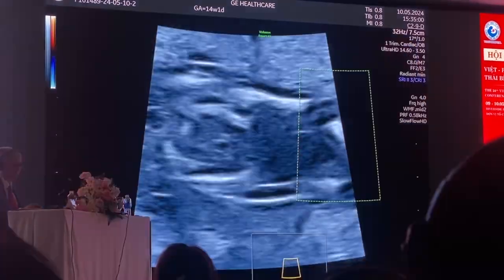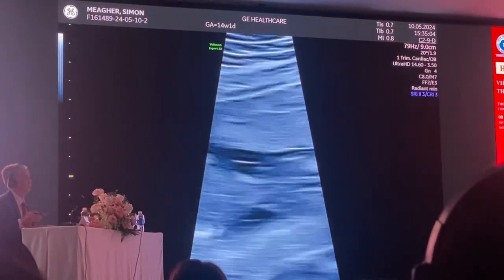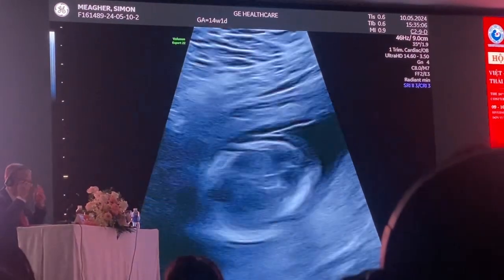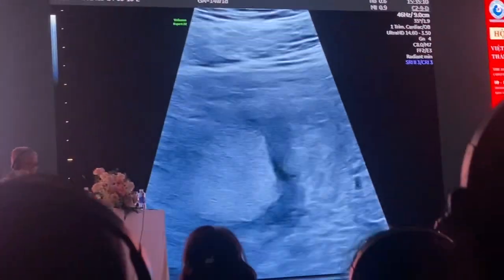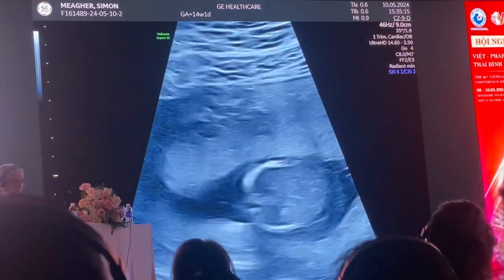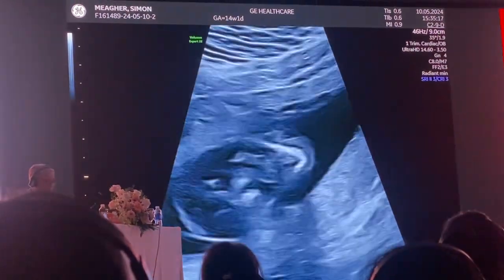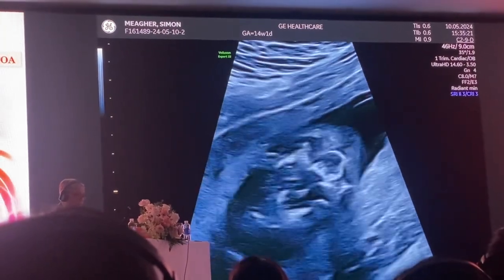So I have not found a cardiac cause, so then I wonder, well, why is this baby hydropic? So the next thing I want to know is is there something skeletal? So I want to look at the long bones for sure. The femur length is okay. And the femur length is the first bone that you look at. So I want to look at the baby's face. And I want to say, is there any facial dysmorphism?